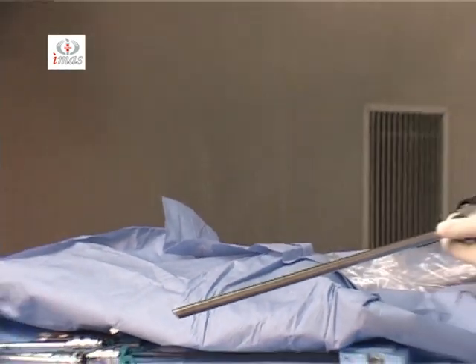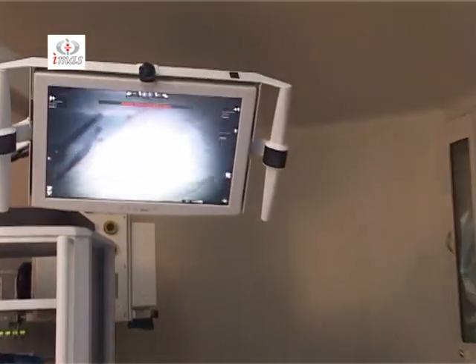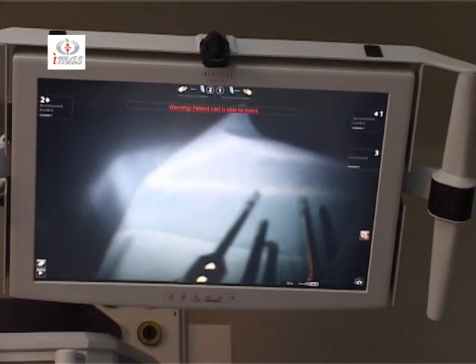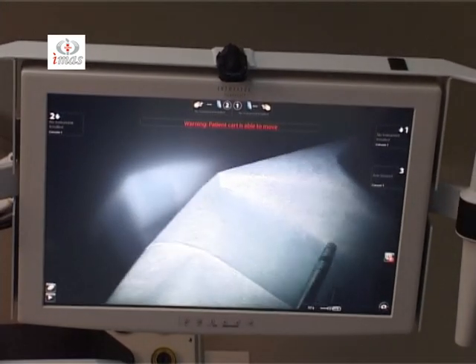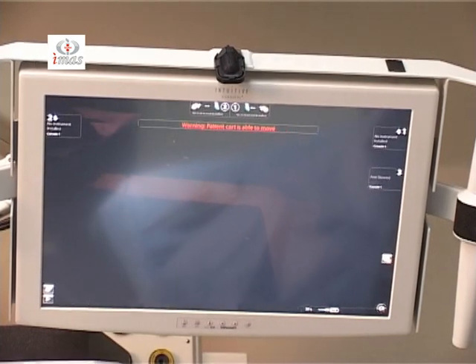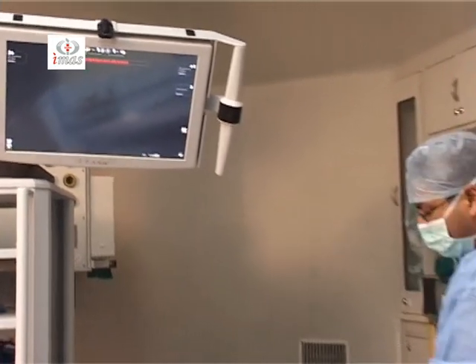If I switch on the illuminator, this is switched on, and now I have to white balance it, and I have to do the 3-dimensional calibration using these buttons. Now I'll switch off the illuminator. I'll keep the scope here.